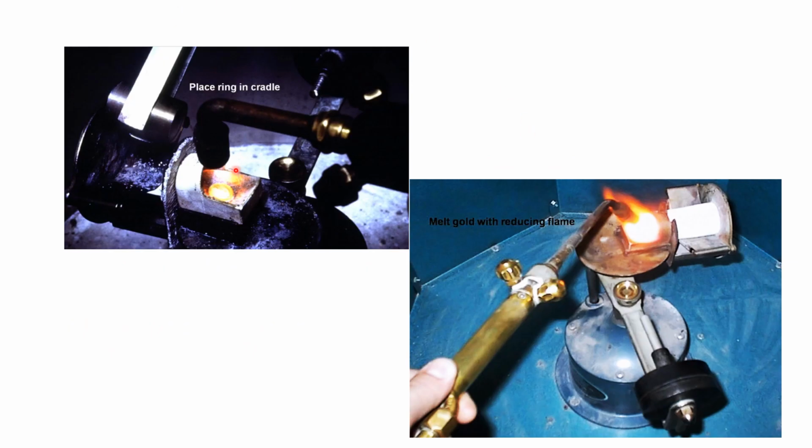See in this figure, your ring is placed inside the cradle area, and here is your molten metal. This molten metal is heated using a heat source. This molten metal will acquire the shape of liquid mercury and it will glow. When this arm rotates, it produces a centrifugal force, and because of this force, this liquid metal will be injected inside this casting ring, where the mold cavity was. Here, this one is the heat source which is melting the gold.